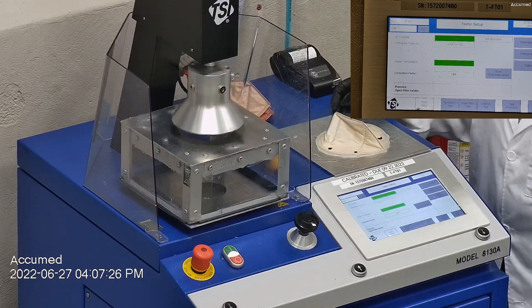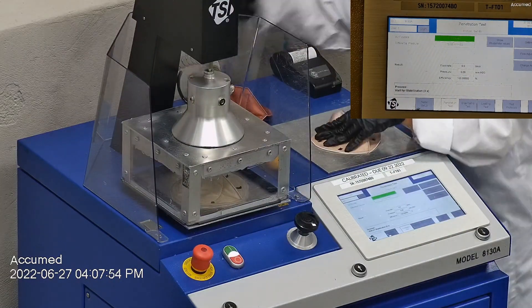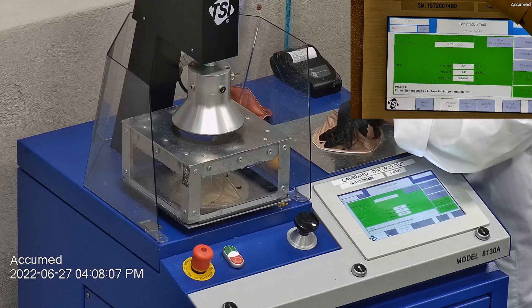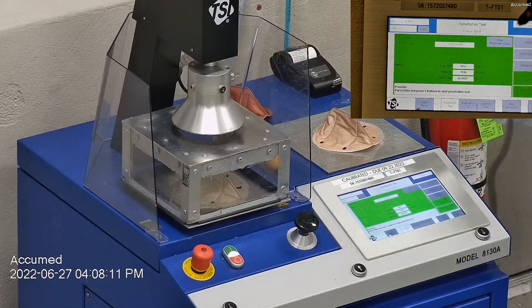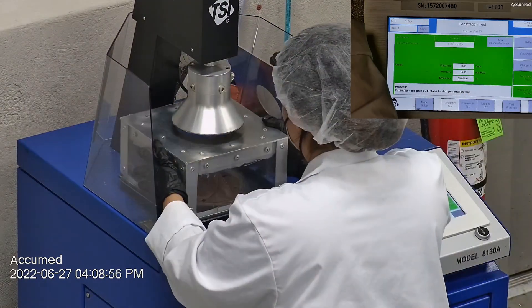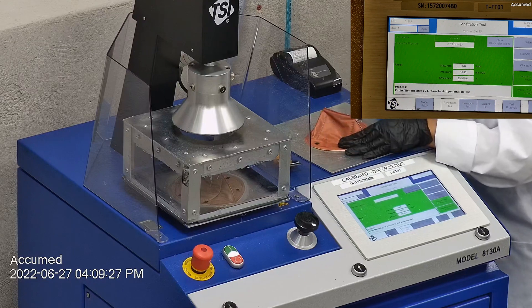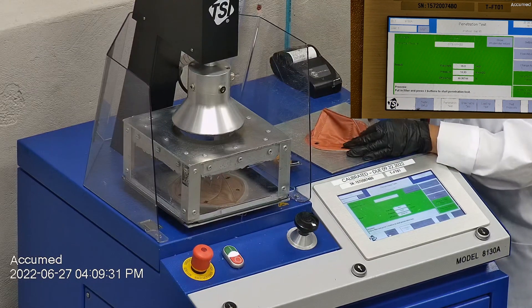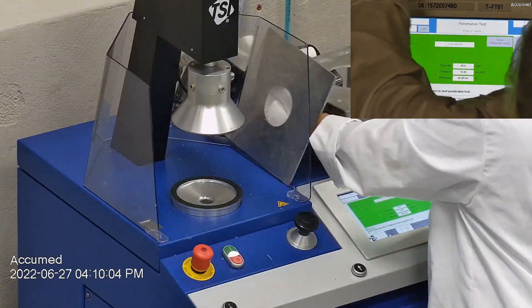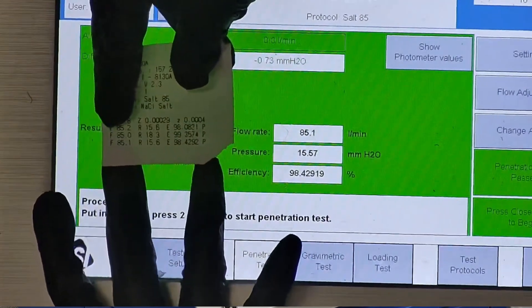The results are displayed on the TSI monitor. F stands for air flow rate, which we test at 85 liters per minute. R is for resistance, also referred to as pressure drop, which correlates with breathability — the lower the number, the more comfortable and breathable the mask is. E stands for filtration efficiency percentage. The first sample tested at 98.09% and had a pressure drop of 15.6 millimeters of water. The second sample had a filtration percentage of 99.36% and a pressure drop of 18.3 millimeters of water. The last sample's filtration percentage was 98.43% and had a pressure drop of 15.6 millimeters of water.